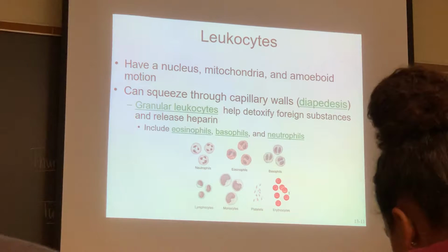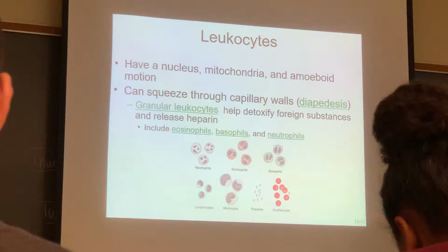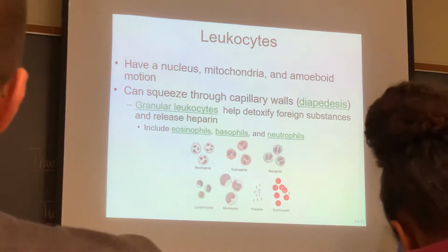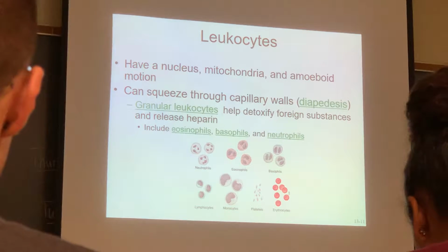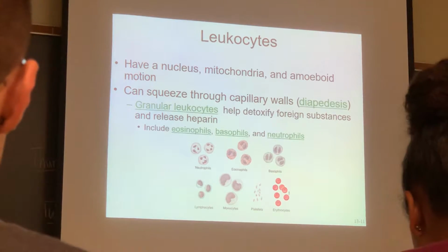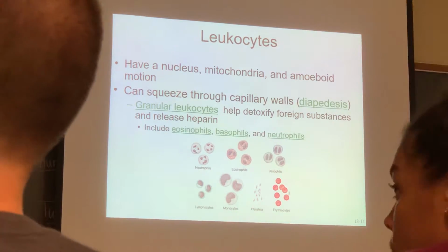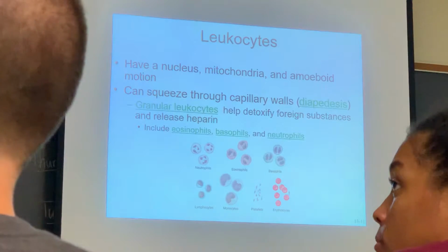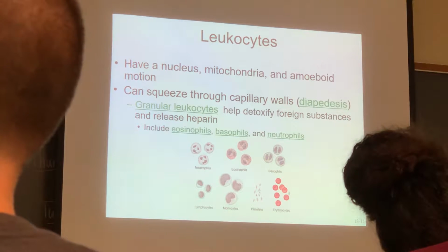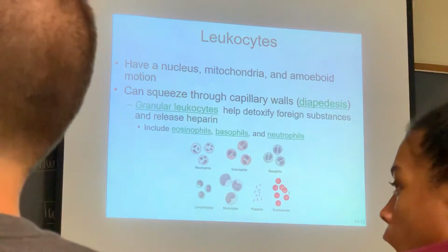The neutrophil is the last one listed under granulocytes. The neutrophil is called the neutrophil because its granules are neutral in terms of the type of dye that it accepts. So the granules generally look kind of a purplish color, which gives the cytoplasm kind of a purple color. Under our magnification, we probably won't see that so well, but the one thing you will see is the nucleus. The nucleus can be in different shapes or morphologies. It can look different, but that's the most distinctive thing. It has multiple lobes to it, which are attached by little tracts of tissue.